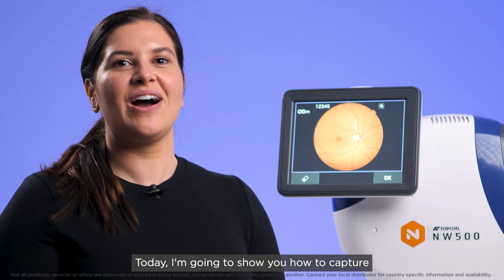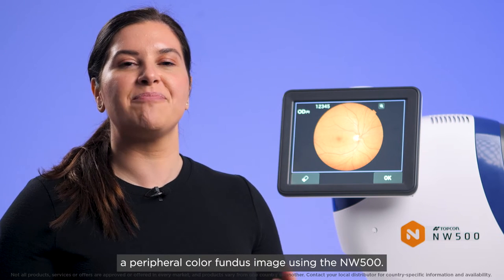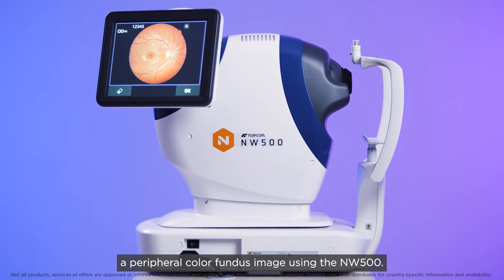Hi, I'm Mary from Topcon Healthcare University. Today I'm going to show you how to capture a peripheral colour fundus image using the NW500.